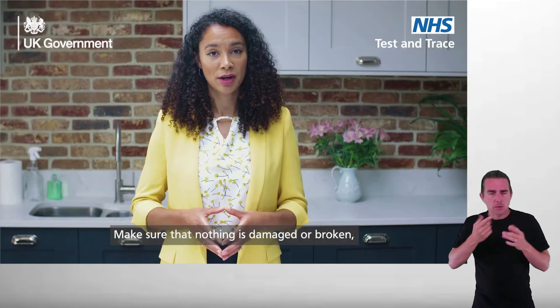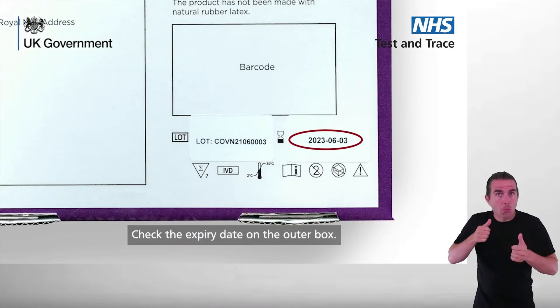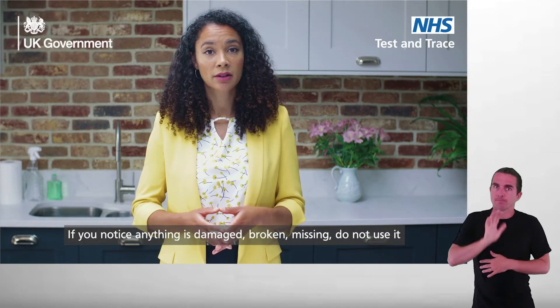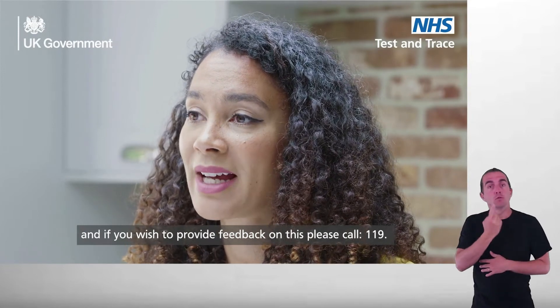Make sure that nothing is damaged or broken before undertaking the test. Check the expiry date on the outer box. If you notice anything is damaged, broken, or missing, do not use it, and if you wish to provide feedback on this, please call 119.